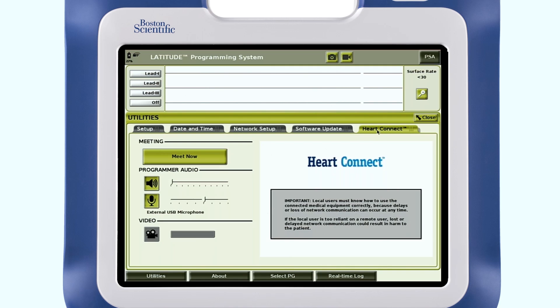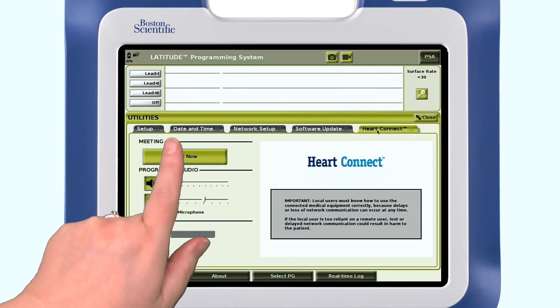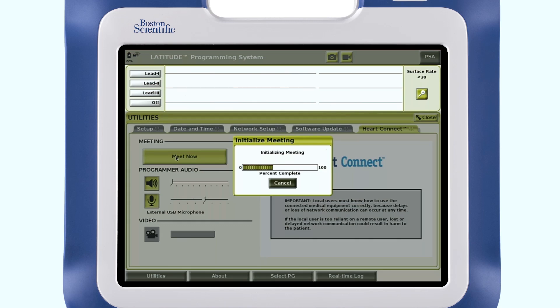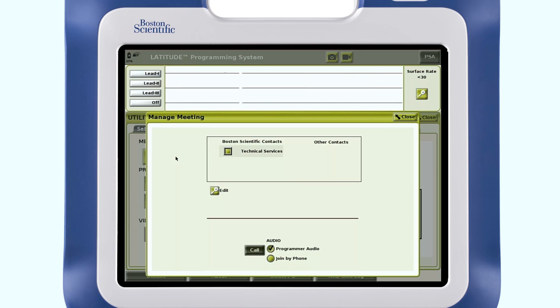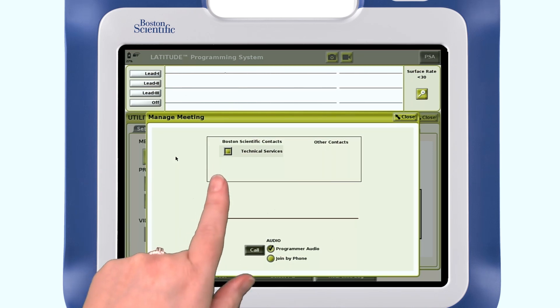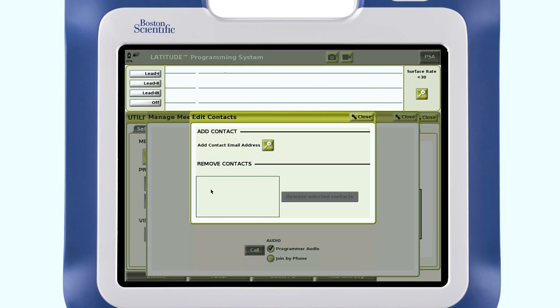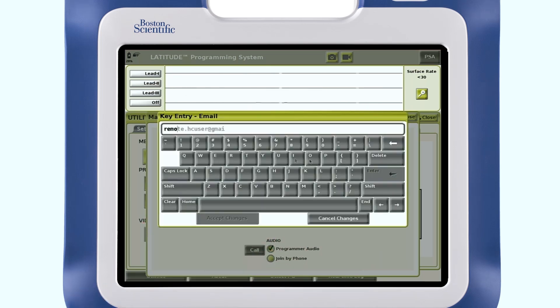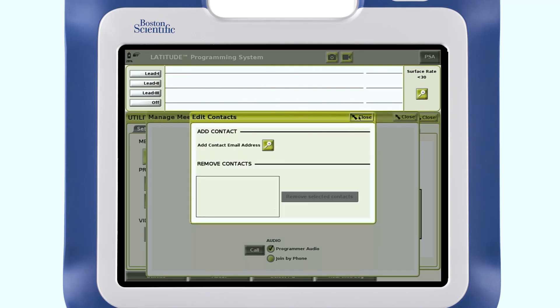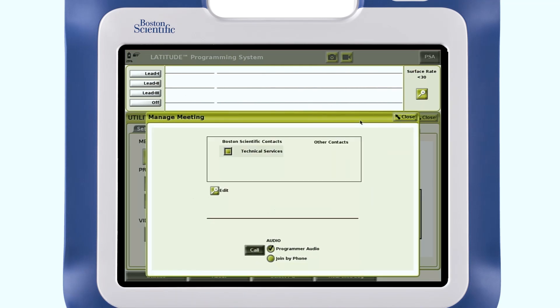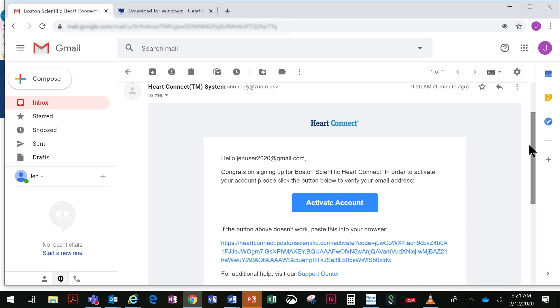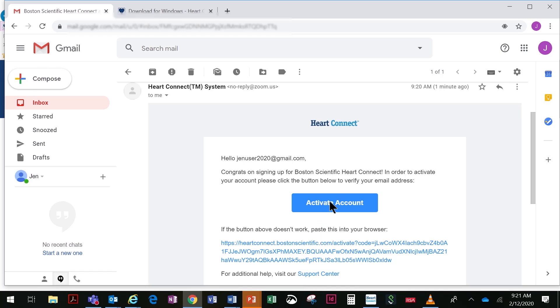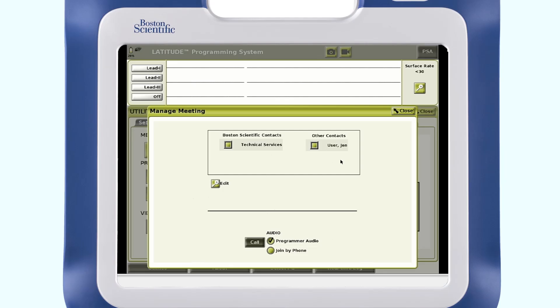To add contacts, click the Meet Now button on the HeartConnect main screen. Press the Details button next to Edit, and click the Details button next to Add Contact Email Address. Once you enter the remote user's email address, press Accept Changes. The remote user will receive an email invitation and will be added to your contact list.